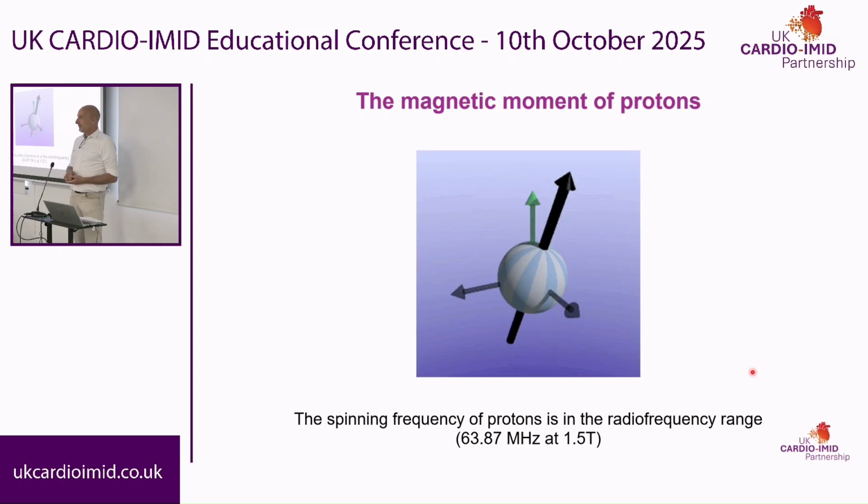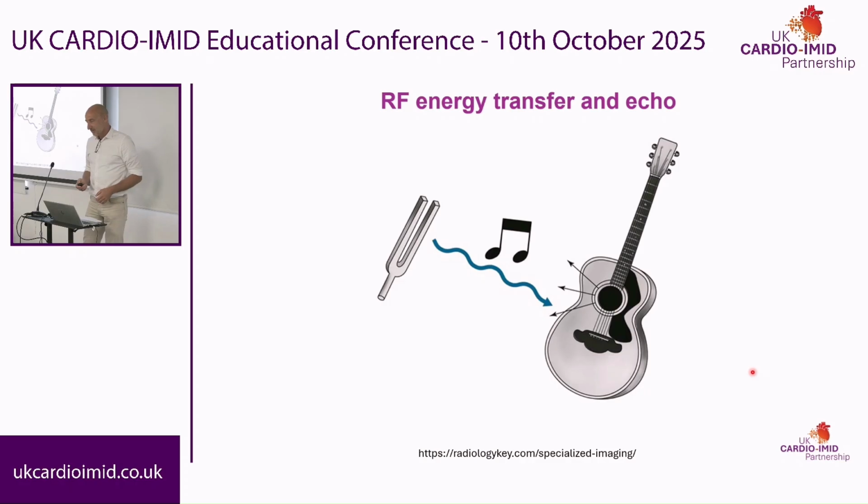What would that do? So if you have something, do you know any examples of a situation in daily life or in school where you use the fact that you can excite something at a particular frequency? You've done a little experiment as a kid. You ever used a tuning fork? Resonance. Give it a tuning fork and a guitar. So what happens? So you put the tuning fork next to the guitar, and if you have an A, and the A string is an A string on the guitar. Thank you. What will it do? It takes up the energy, and then it sends you an echo back because it will start to vibrate. That's exactly what we're doing in MRI.